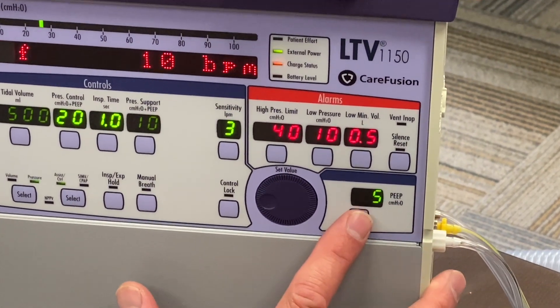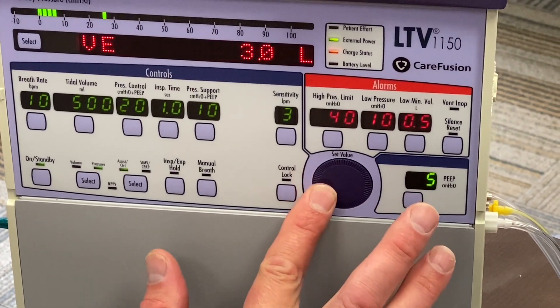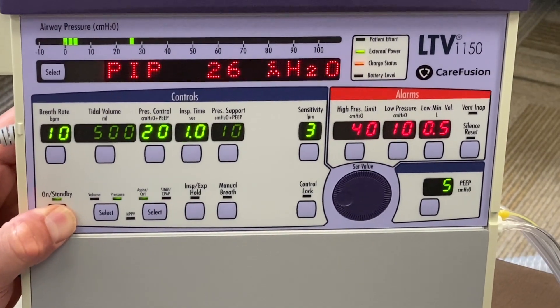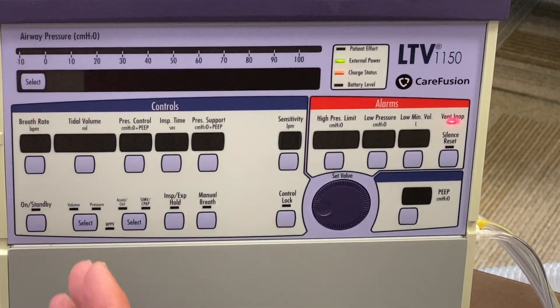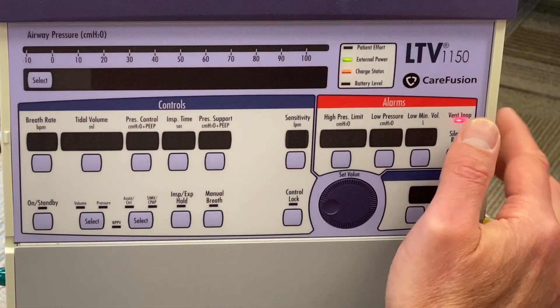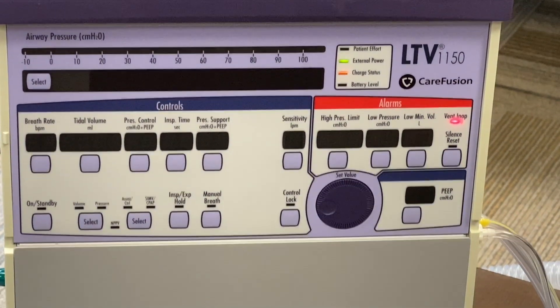Down here is where PEEP is set — same function as everything else. To shut the machine down, hold this button until you get a power-down prompt. You'll hear a solid alarm; that's to prevent accidental shutdown by a sibling or anyone else in the house. You have to press silent-reset in order to stop that alarm and complete the shutdown.